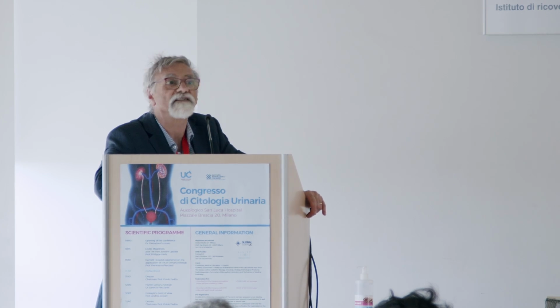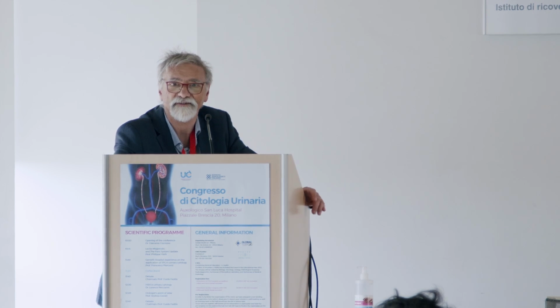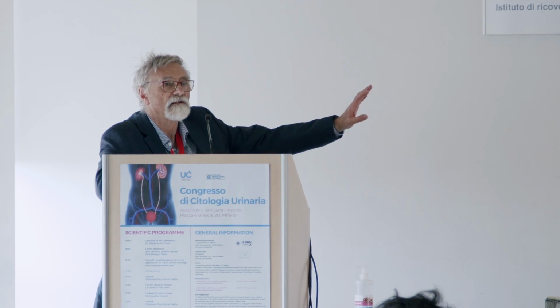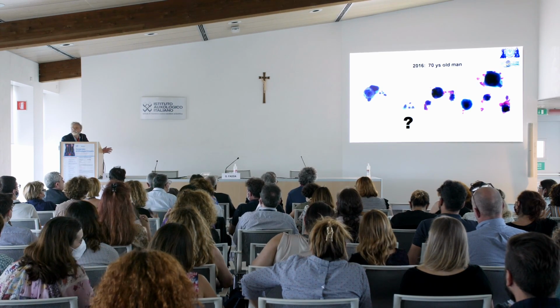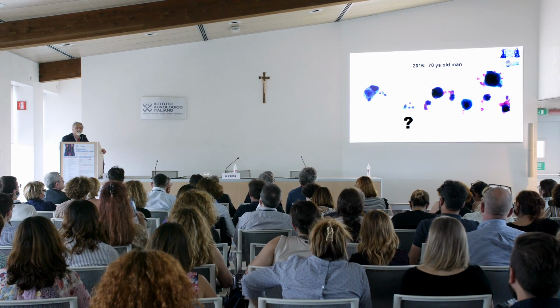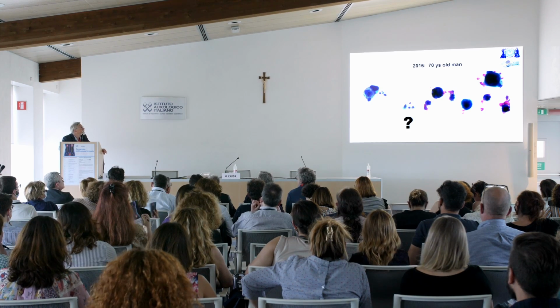So, what's your opinion, audience? Not the professor, I think, though finally also the opinion of the professor, but the audience, please. Now, the young people, the audience. Suspicious? Suspicious, okay, yes.